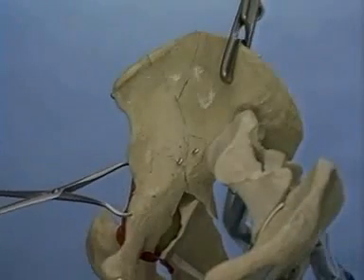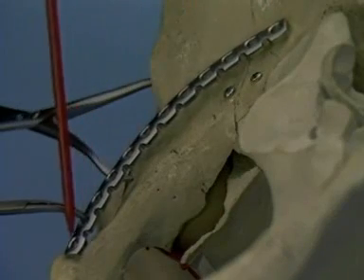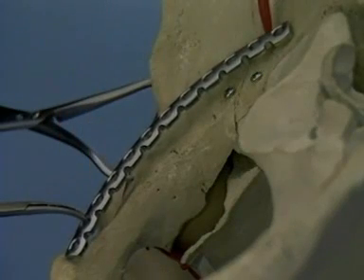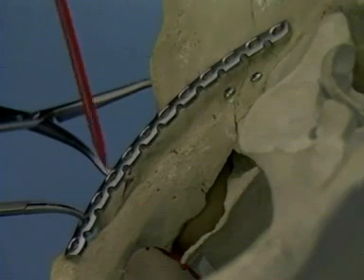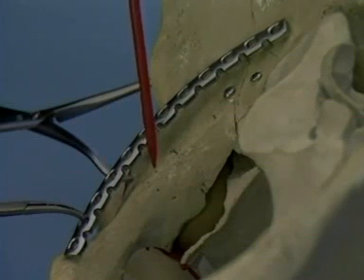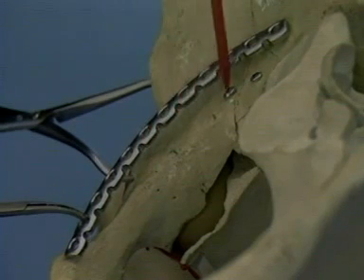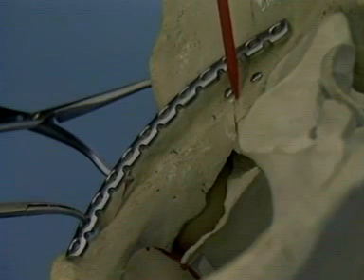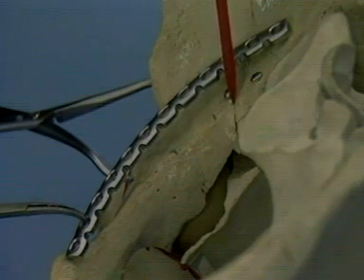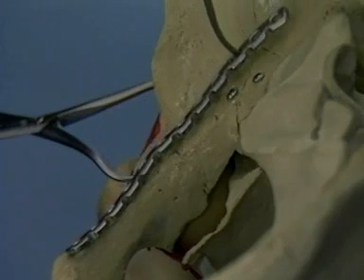A 12-hole plate is seen to be the correct length for fixation from the internal iliac fossa to the superior pubic ramus. It may be necessary to adjust the curve of the plate to match the individual pelvis. The plate is concave over the superior pubic ramus, convex over the pectineal eminence, and then again bent in a concave fashion over the internal iliac fossa. The fully contoured plate is now seen as it will lie along the pelvic brim.